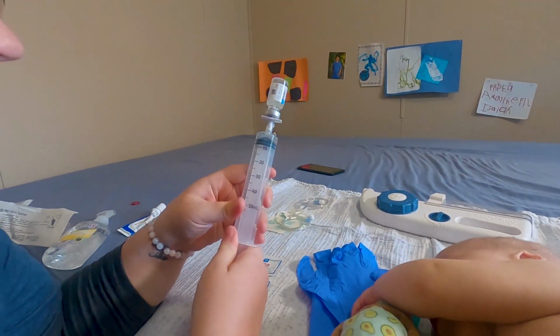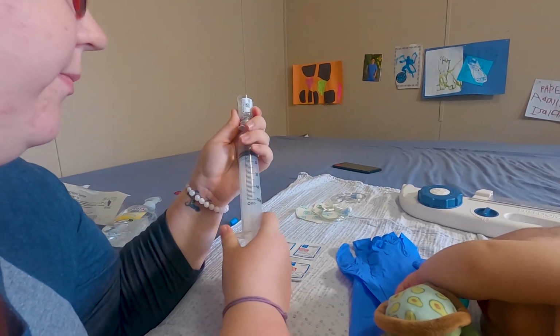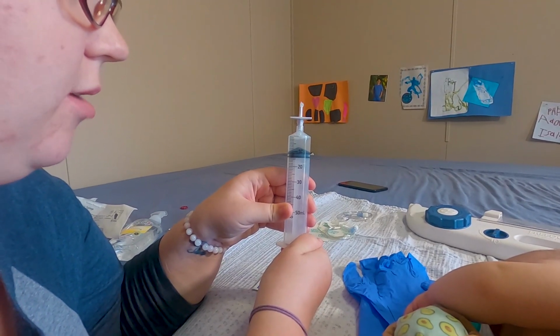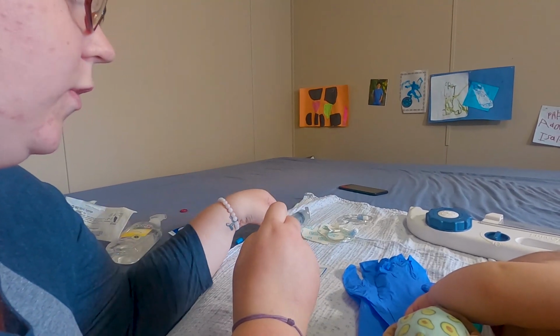We're going to draw it back. His infusions, now we have downgraded them. It should be about, let's just get rid of air bubbles. Should be right at 10. You can see that's at 10. Okay.